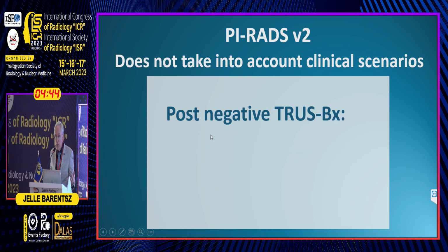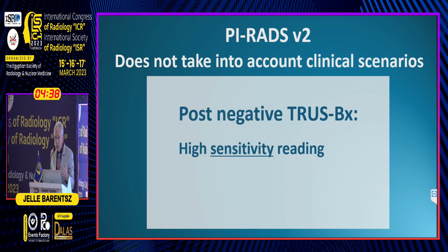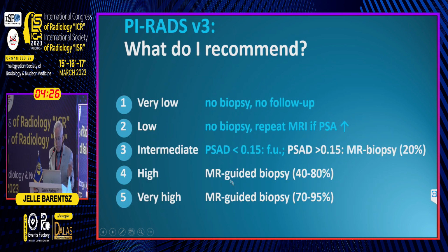In a post-negative biopsy patient, you really want to find the tumor. So high sensitivity reading is more important. You want to decrease the number of false negatives because the patient has a high clinical suspicion. You really want to find the tumor. So the clinical scenario does matter.